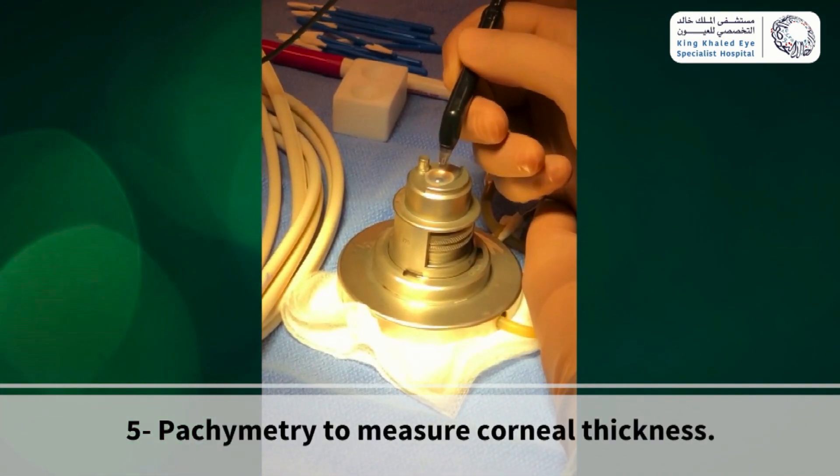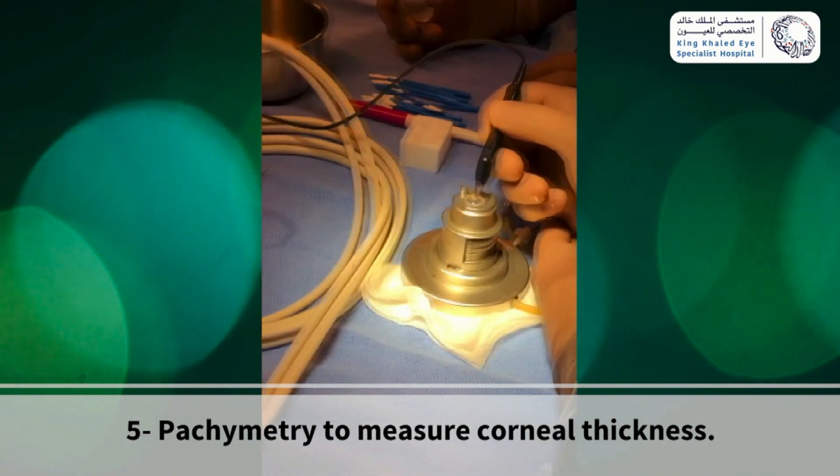After that, place the probe on the surface of the cornea and have an assistant record the reading.